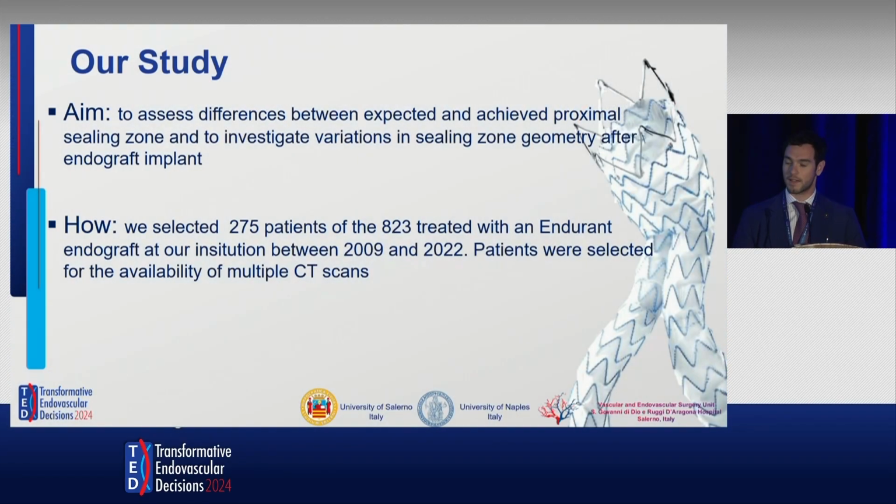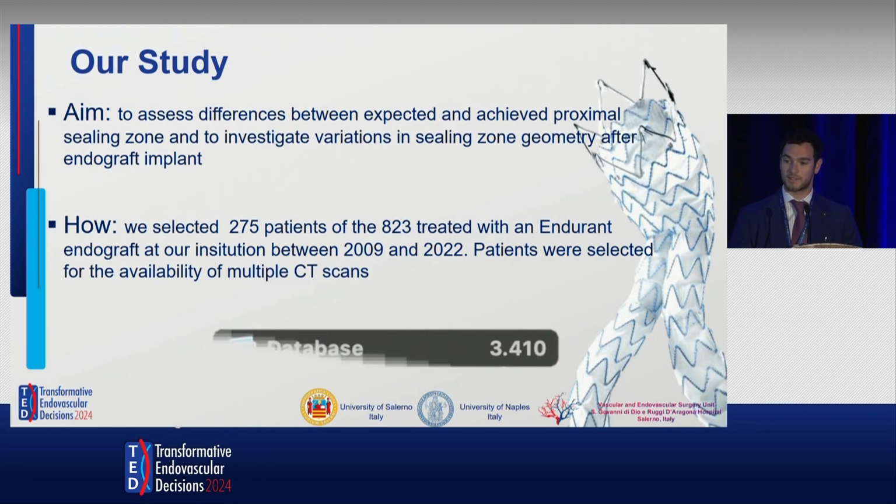In our ongoing study, we aim to assess differences between the expected and the achieved sealing zone and to investigate variations over time and how events interact with the aortic sealing zone. We selected 275 patients treated with the same endograft at our institution and followed them up with CT scans.